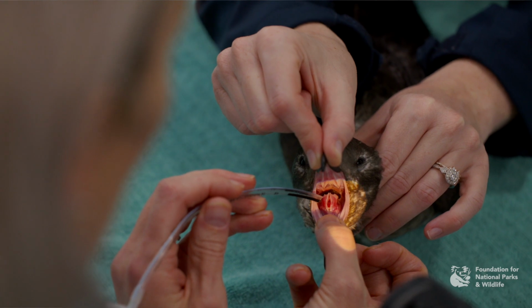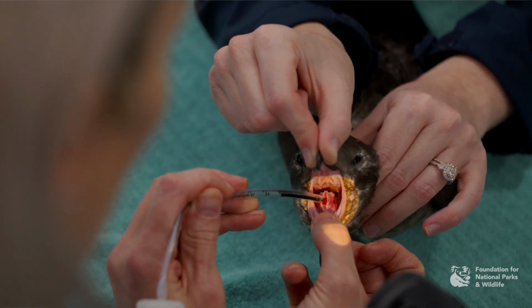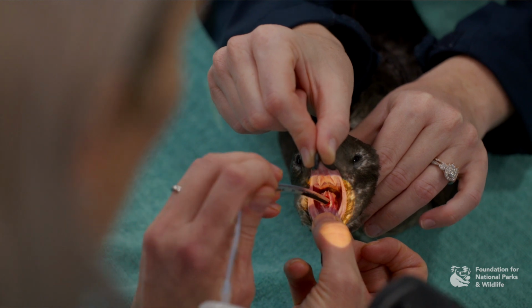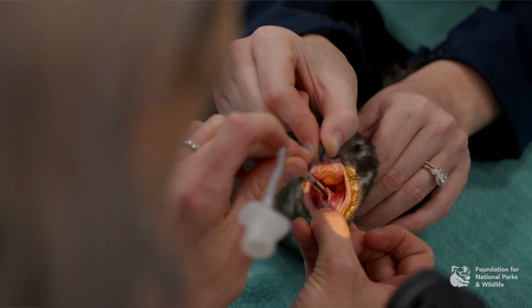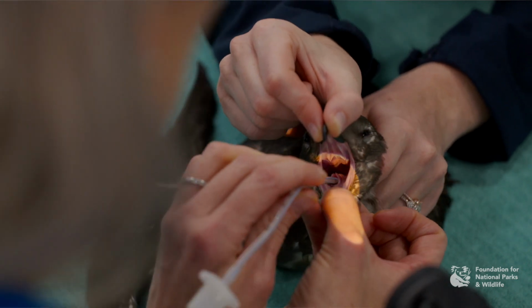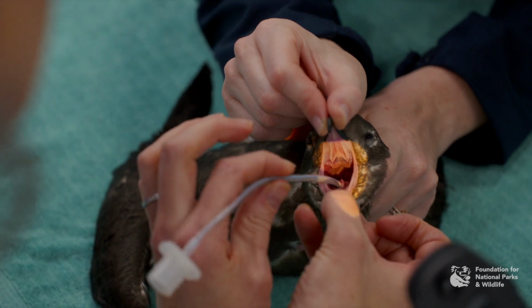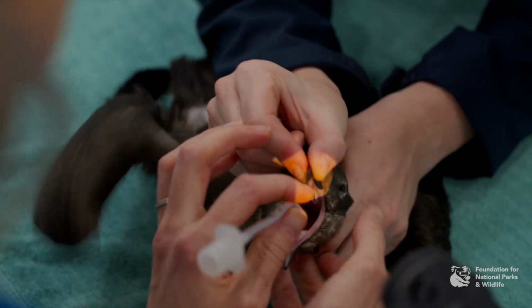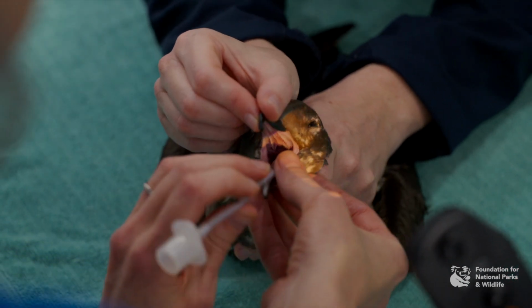When you're intubating, we're going to be going into the glottis. You can see that there's this small projection coming from the bottom of the entry. You want to slide your ET tube over the top of it, being very gentle and slowly sliding and twirling the ET tube in. Once you pass it, you can safely tape the tube in place. Sometimes they will get irritated by it. You can spray a little bit of lignocaine spray to help you.